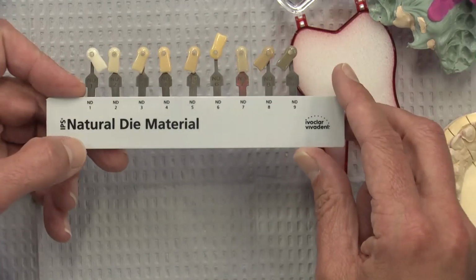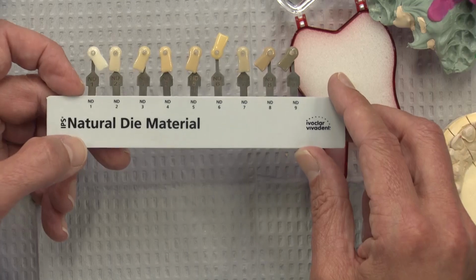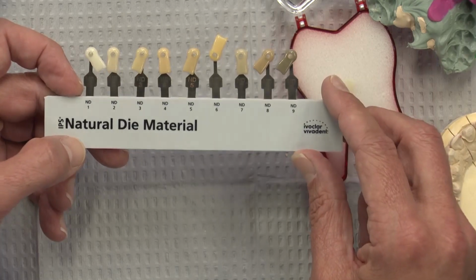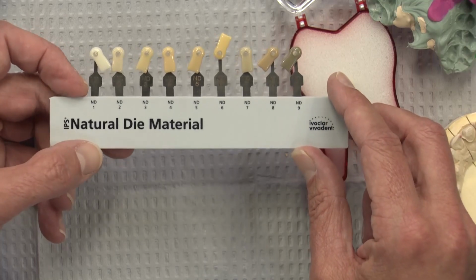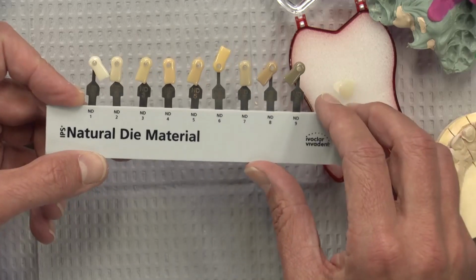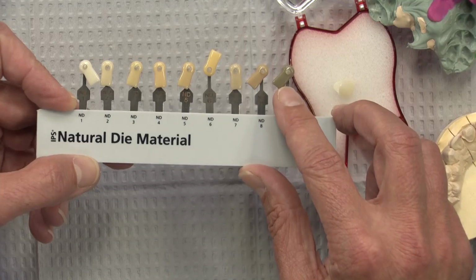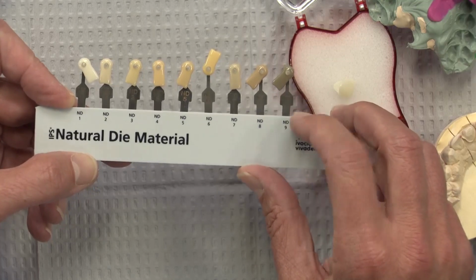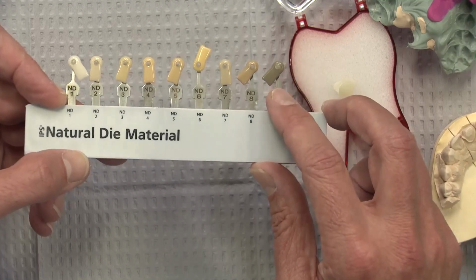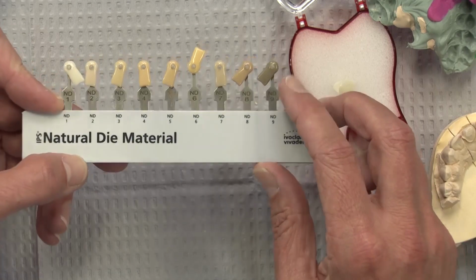My advice is, if you're going to be doing more translucent anterior restorations like e.max or anterior BruxZir, this is a really good investment: one of these stump shade guides. You're not going to find a ton of teeth that are dead ringers for these shades, but if you just pick the closest one, on a tooth like this it's probably this one, when you get that blackish or dark gray look, and just take a photograph of the ND9 tab next to the tooth so our technician has an idea of how dark it is compared to this.